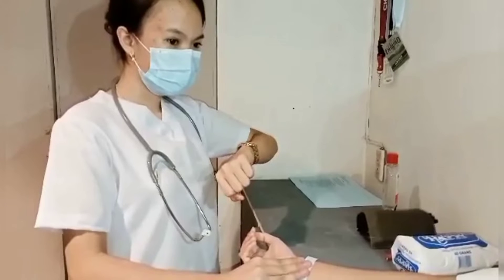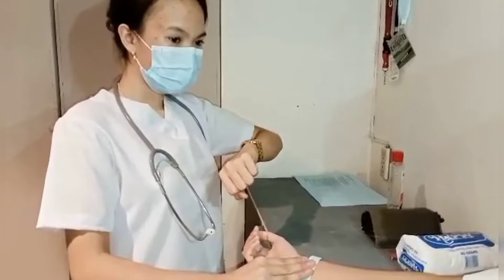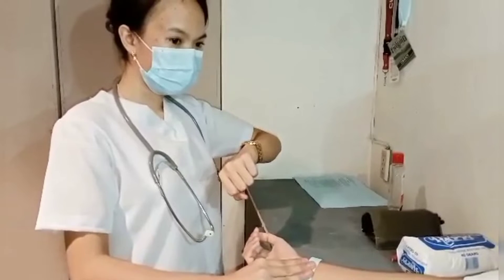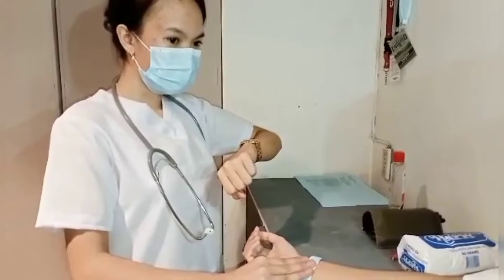Assume the same position as in taking pulse rate, but note the rise and fall of the client's chest with each inspiration and expiration without the patient's awareness. Count the number of respirations for one full minute.